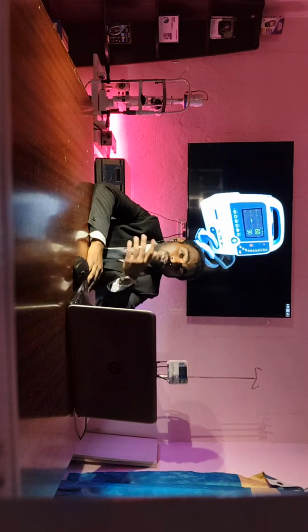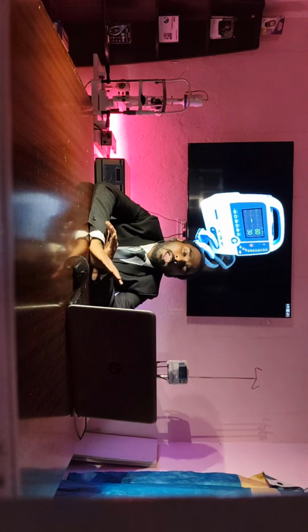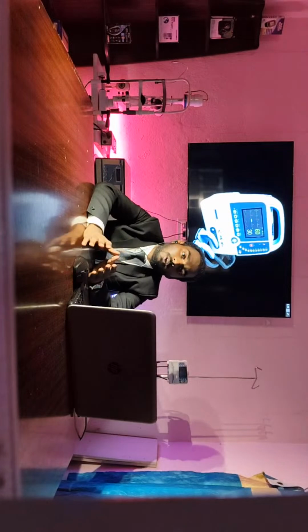defibrillator. When it comes to the cardiology department, everyone can say there is a defibrillator, an ECG, and then a stethoscope. Even the stethoscope is an instrument used in the cardiology department. Yes, every department uses the stethoscope, not only cardiology. They need some vital signs which are common: temperature, heart rate, pulse rate, very common for every department. Like that, the defibrillator is one of the important equipment in the intensive care units.